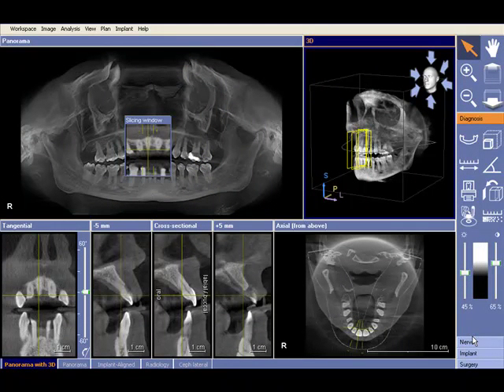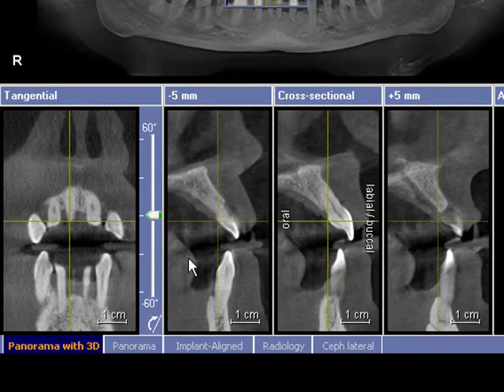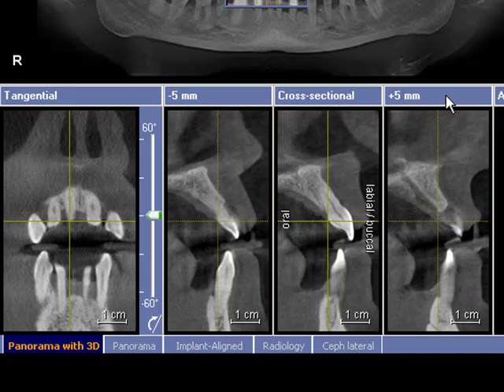In this example we'll be showing the measuring tool and we'll be able to measure any distance on a one-to-one scale. We'll be able to use these windows here on our panorama with 3D, the tangential, the minus 5mm, cross section and the plus 5mm. You can also use down the bottom here our separate tabs — we've got panorama, implant-aligned and radiology.